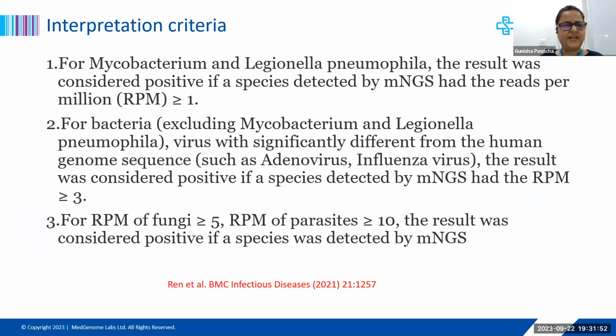In the literature, there are multiple interpretation criteria because this is becoming more and more popular. A lot of interpretation criteria are given by different authors. I've not put all of them, just one for you here, but it undergoes debate, and we also have our own interpretation criteria based on our experiences.